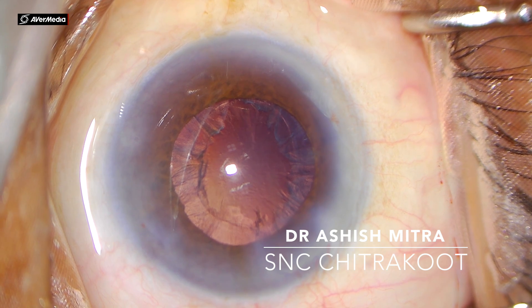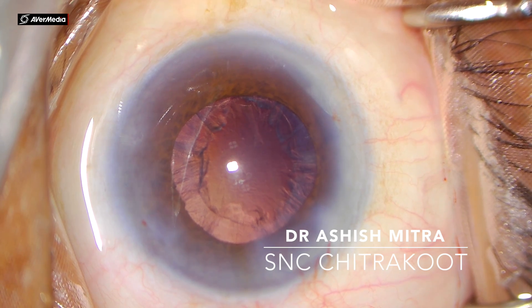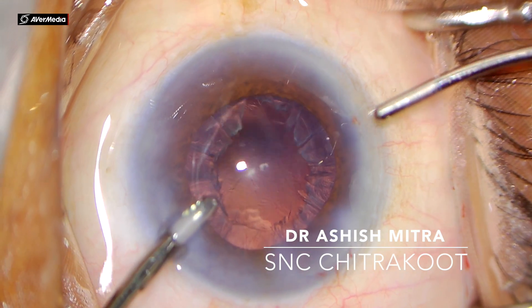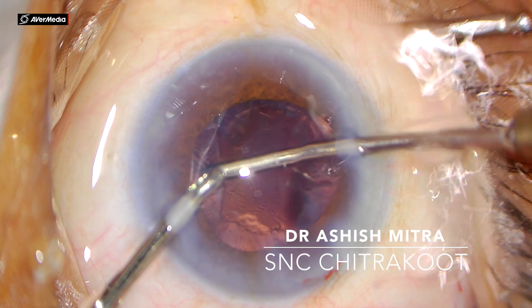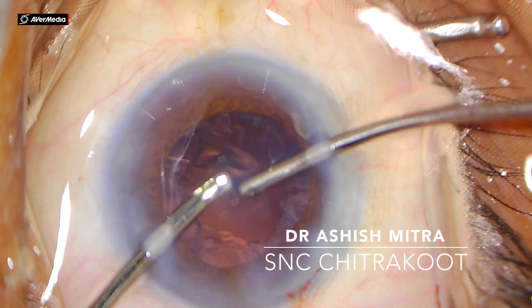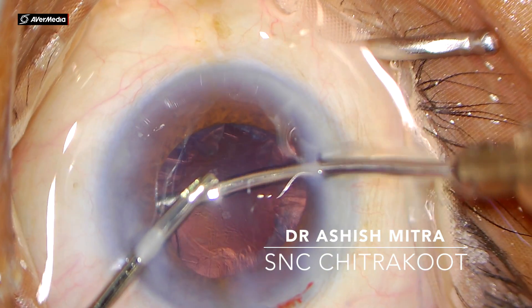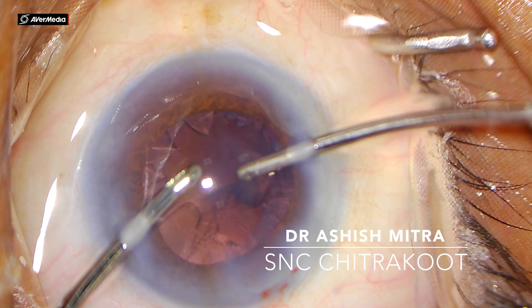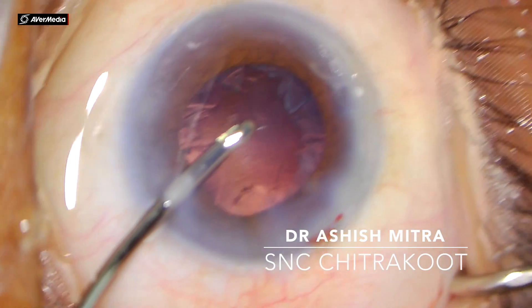Now I go inside with the irrigation and aspiration cannula; I would be aspirating my cortex. You have to peel it and bring it to the center. If your rhexis is intact, as I mentioned in my last video, if you are holding the capsule you won't be able to peel it to the center. So you need to be confident that you are holding the cortex and not the capsule.